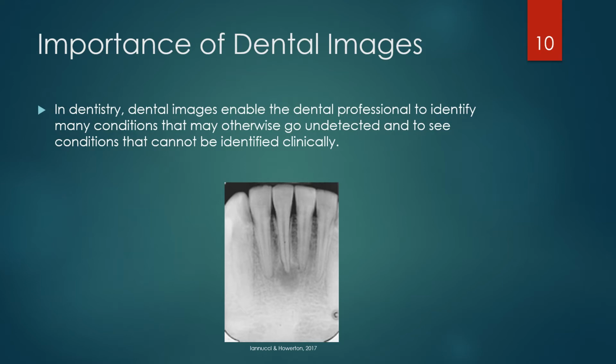The importance of dental images, and I cannot stress enough how important dental images are. In dentistry, dental images enable the dental professional to identify many conditions that may otherwise go undetected and to see conditions that cannot be identified clinically. So when you have a patient who, for whatever reason, would like to refuse taking radiographs, then it is important to stress to that individual that there are many dental diseases and conditions that have no clinical signs or symptoms and that can go undetected without the use of dental images.